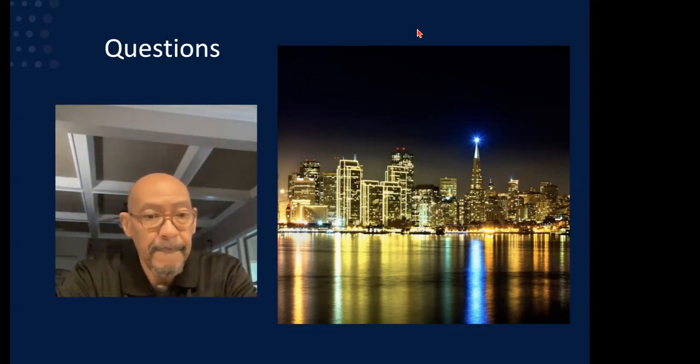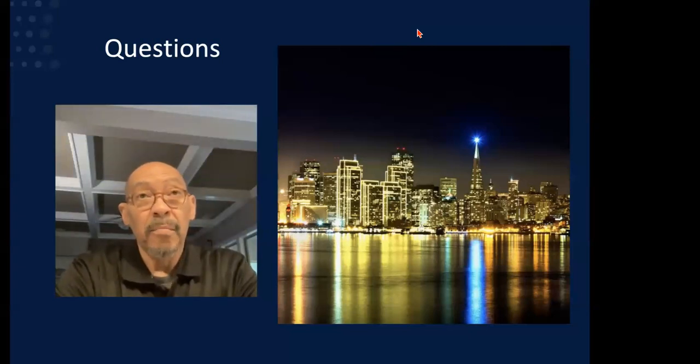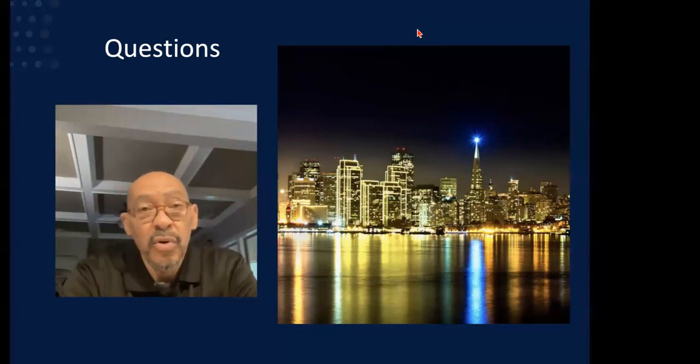Okay, we have another one here from Ibram. Hello, what about the potential space when implanting the lens and the risk of retinal detachment after lens replacement? So if you are a high myope, retinal detachments are high anyway. It doesn't matter what surgery you're having. But if you're moderate to low myope, and that's really depending on the distance of the retina to the capsular bag, you should do just fine, unless you've got a disease process that you're also managing.